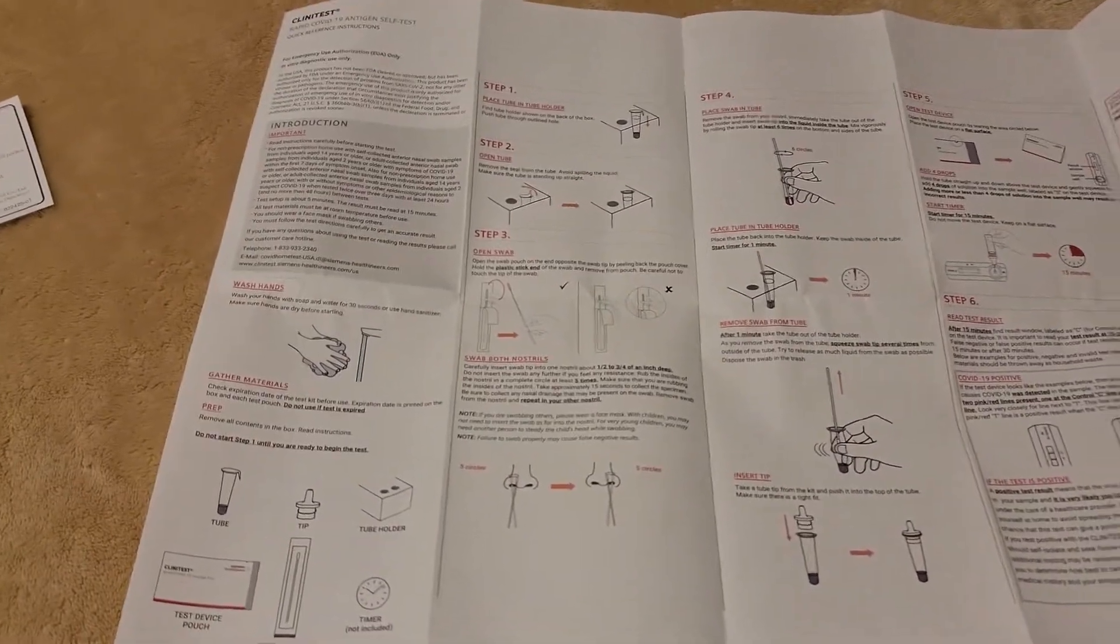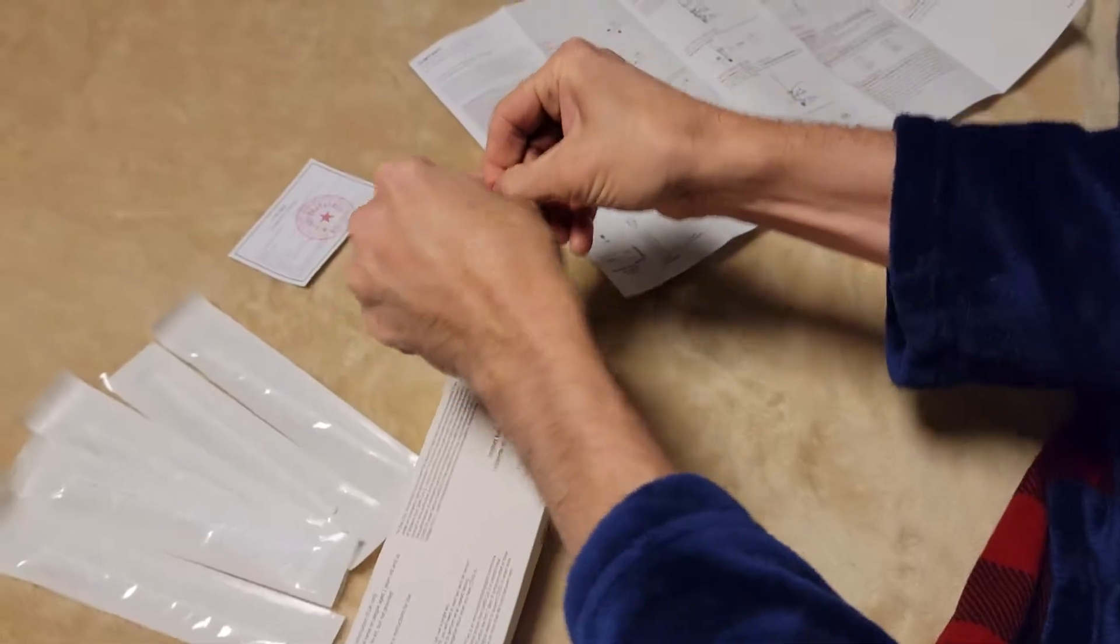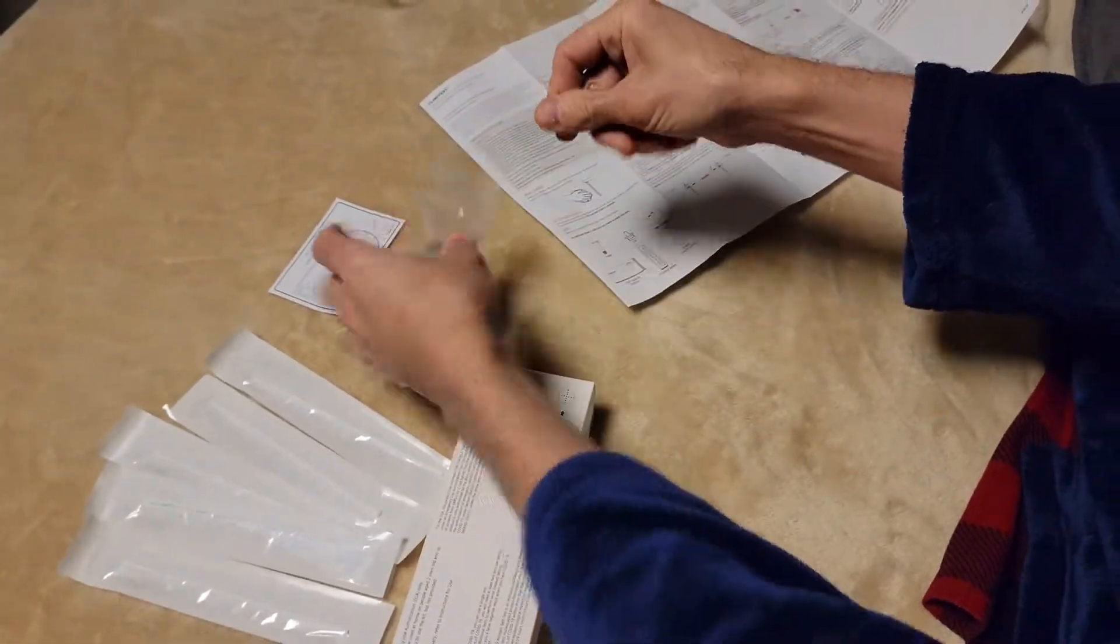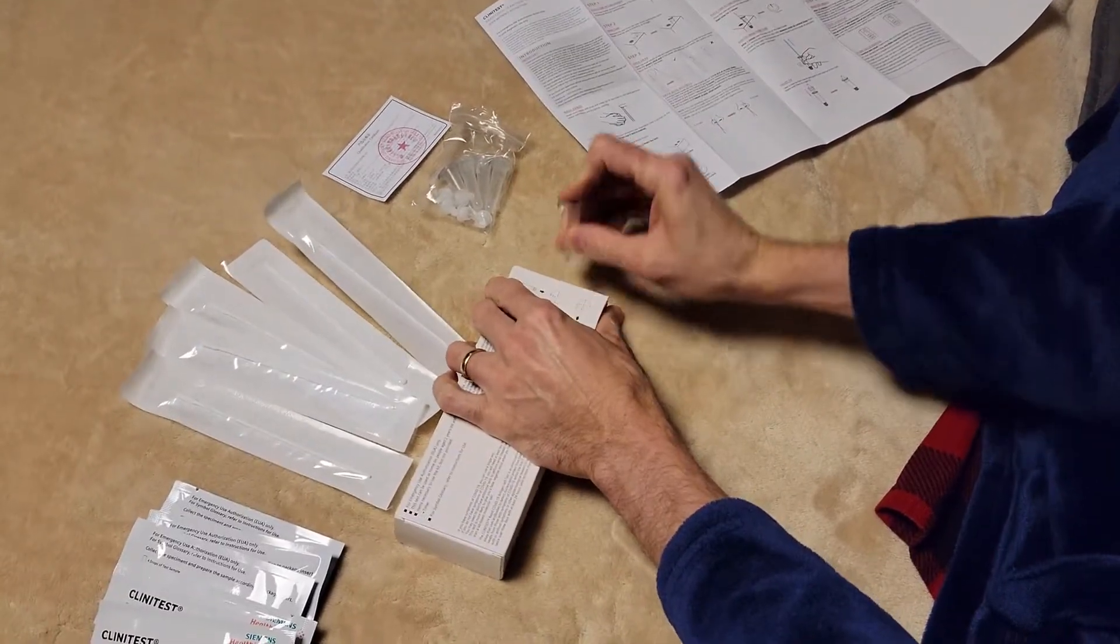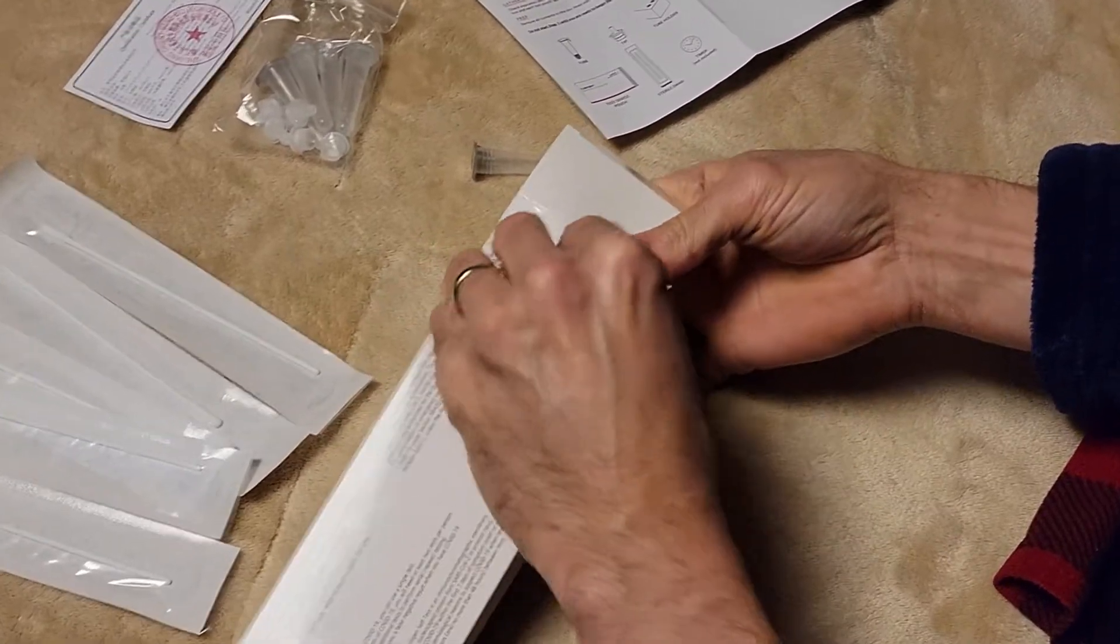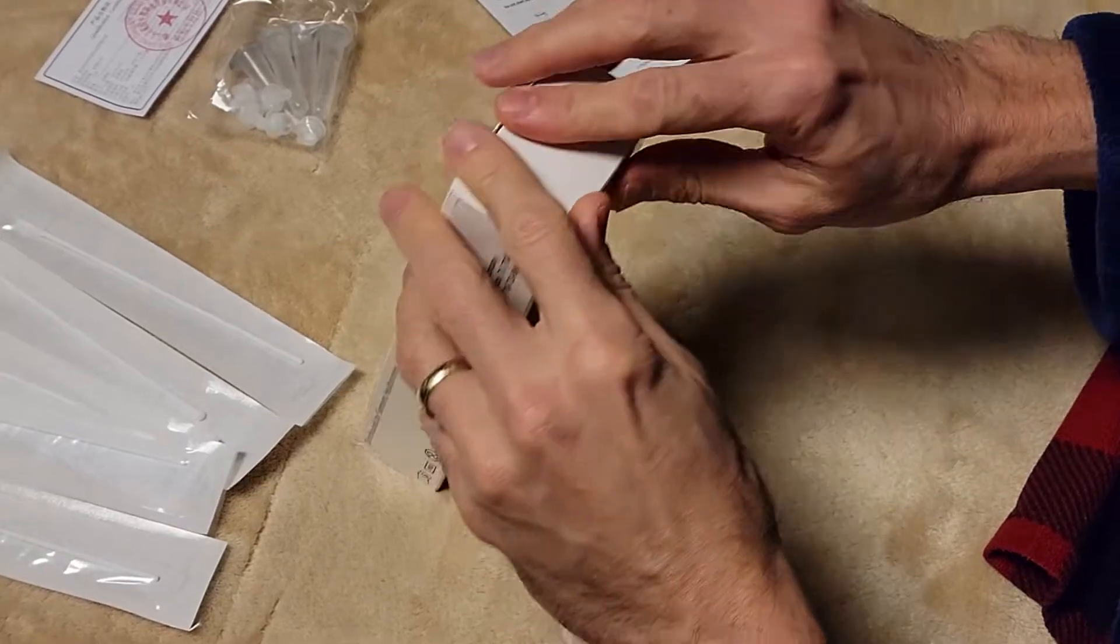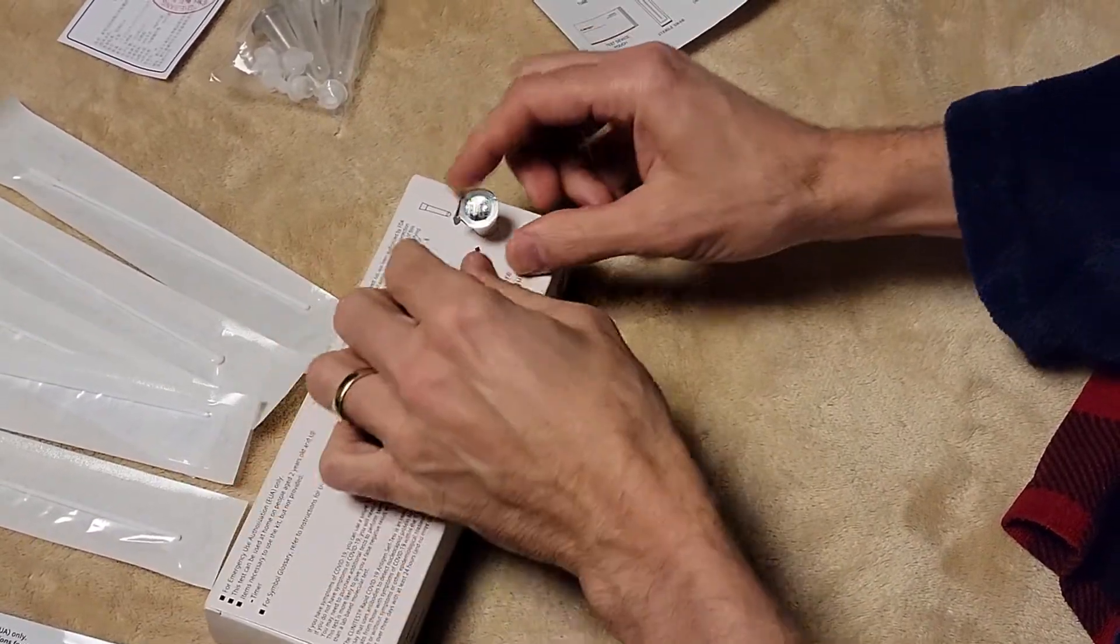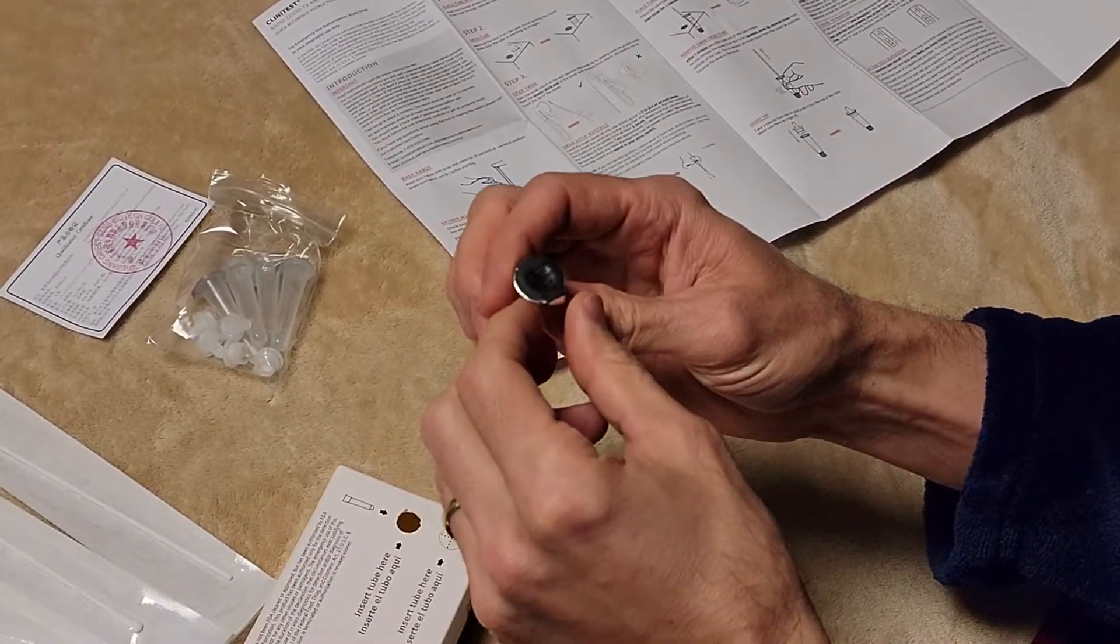And then this box which has these little cutouts here and the instructions. So we're going to go ahead and bust this out real quick. So washed our hands already. Next step, we're just going to open this up and pull one of these out. And it says these go right in here, insert tube here, and I'll punch that out there on the box. There we go. Make sure your box is solid. Okay, and it says so place the tube in the holder.